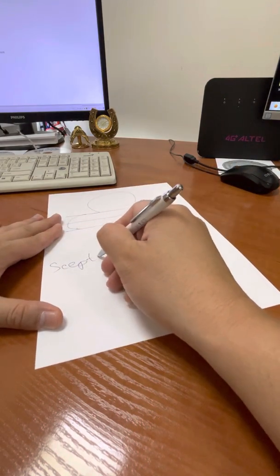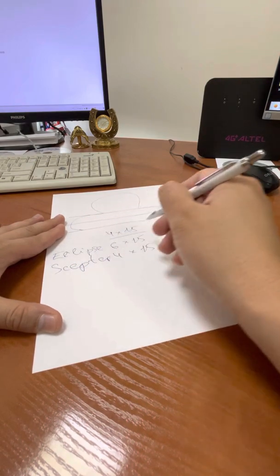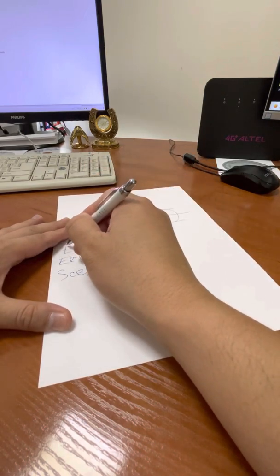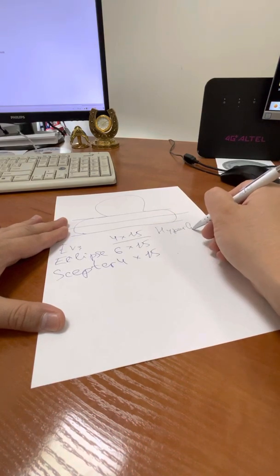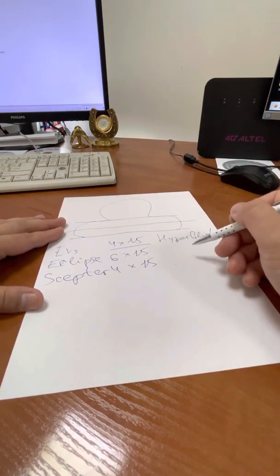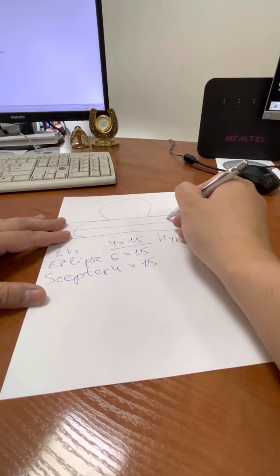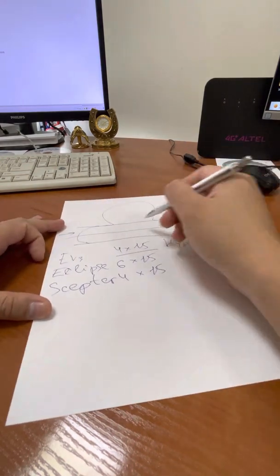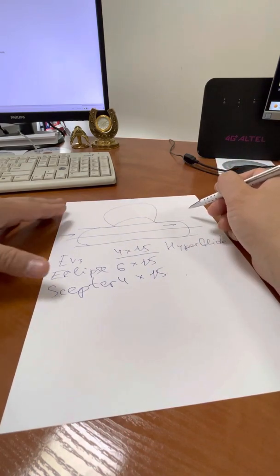Scepter, Eclipse from Balt, and Scepter from MicroVention, and from Medtronic it's Hyperglide. I stopped using the Hyperform balloon. They are short, 4x7 or 7x7, and when you inflate the balloon, it all the time tries to go with the flow distally. It's an unstable balloon, and it's bulging inside the aneurysm.